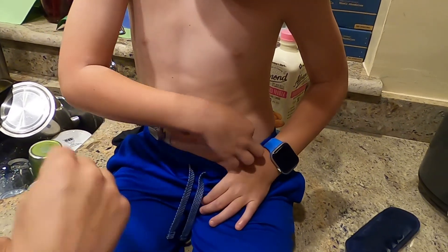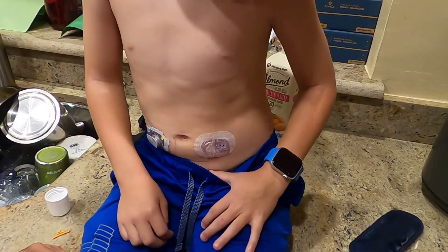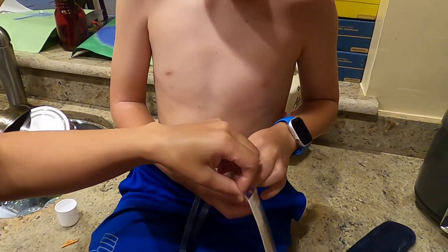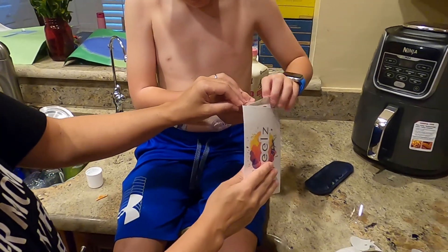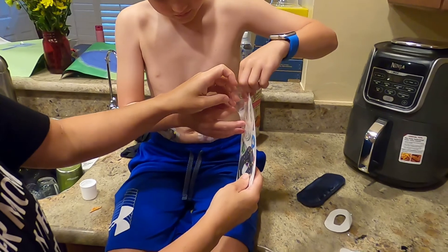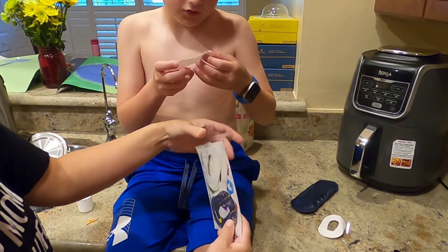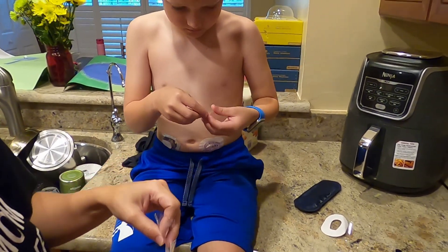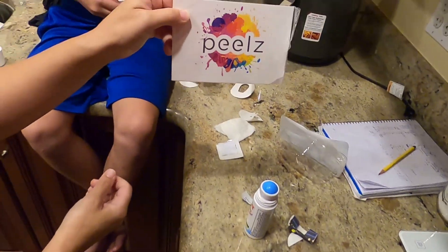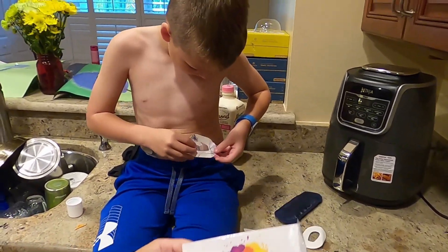You put your fingers around it three times just to make sure the adhesive sticks. We like Pump Peels. Abel does have eczema. I wouldn't say he has sensitive skin, but we have certainly had trouble with some of these adhesives — like extra, some different brands. Pump Peels seems to work really well for his skin. We haven't had any issue with it.